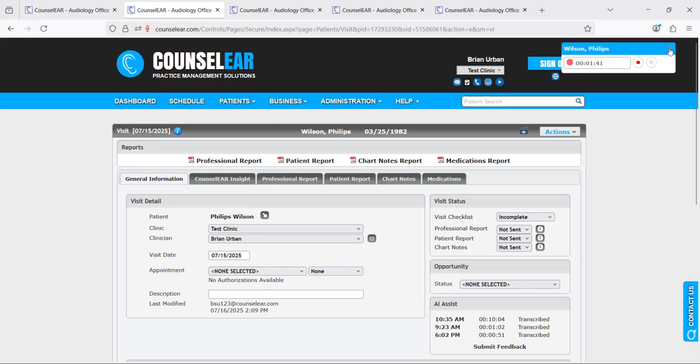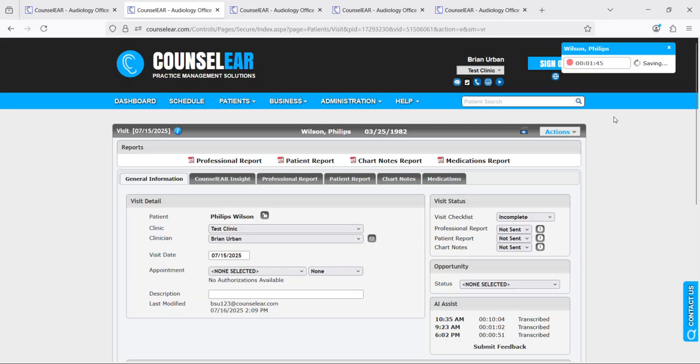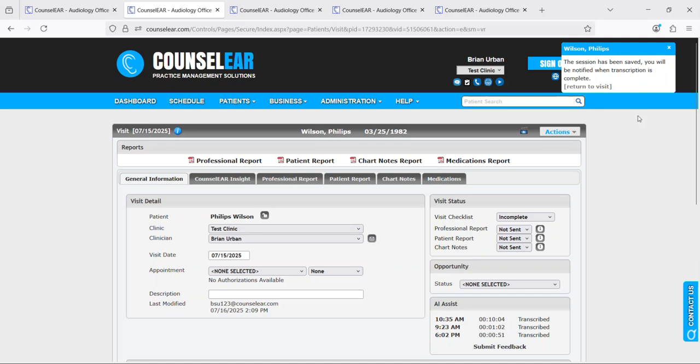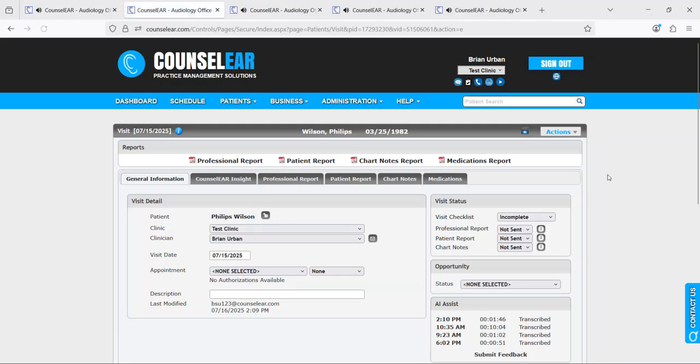Now what I'm going to do here is go ahead and save this one, but this one wouldn't have great information so we're going to see the process for what happens. First off you get a message saying it's been saved, you'll be notified when the transcription is complete. So typically here you just click return to visit.